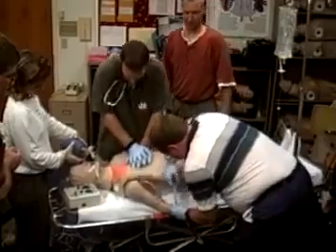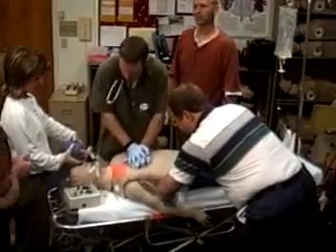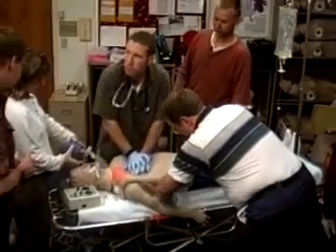Intubate and ventilate the patient. Monitor and evaluate blood pressure. Start IVs and defibrillate just as you would a real patient.